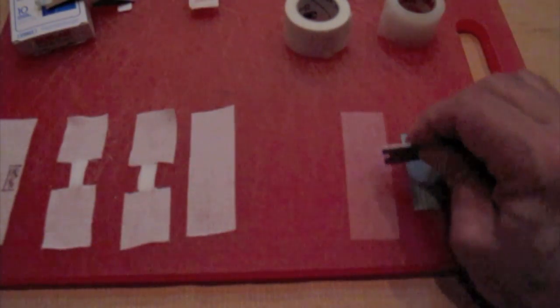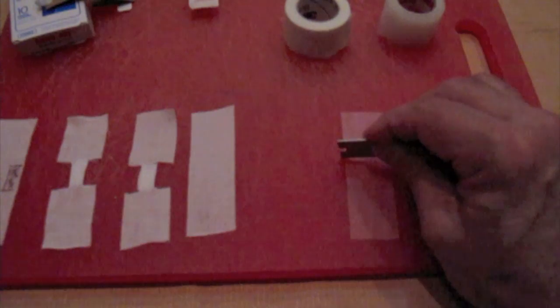You can also do this with, in this case, clear micropore or transport tape. This tape actually has little perforations, and you could tear it by hand or use your razor blade. And again, we're just going to fold those little tabs back. And we've made a nice little bridge, non-adherent, with two anchor tabs on either side.